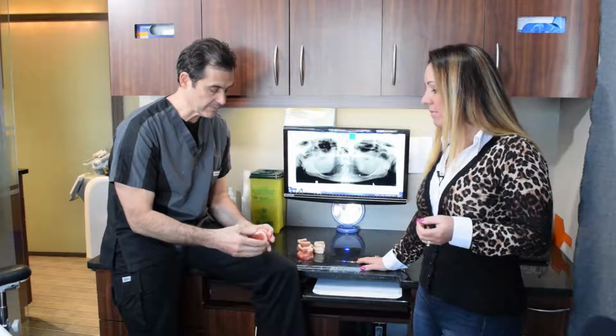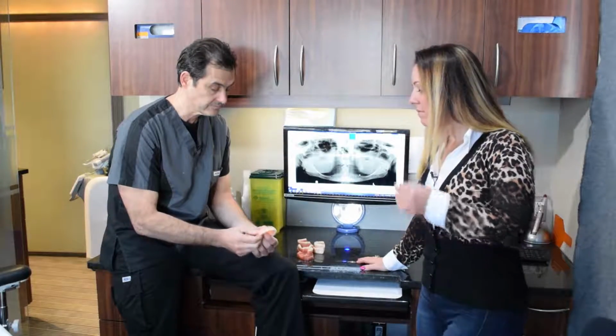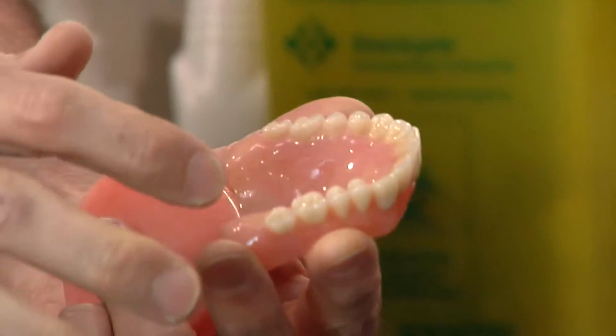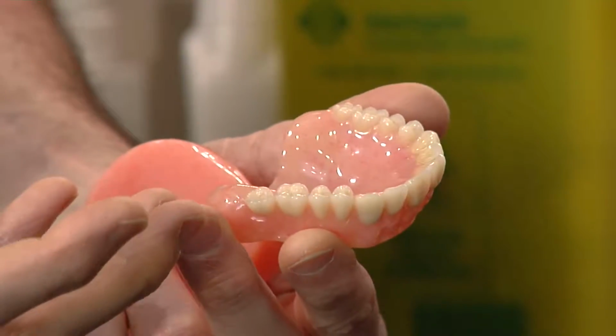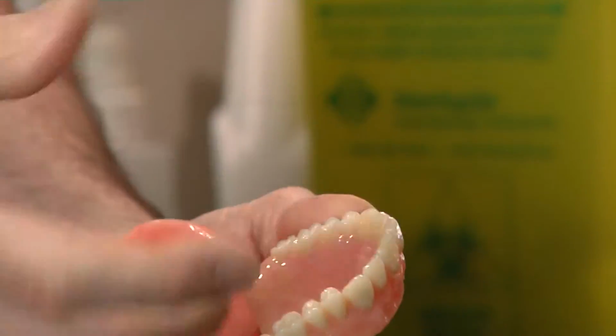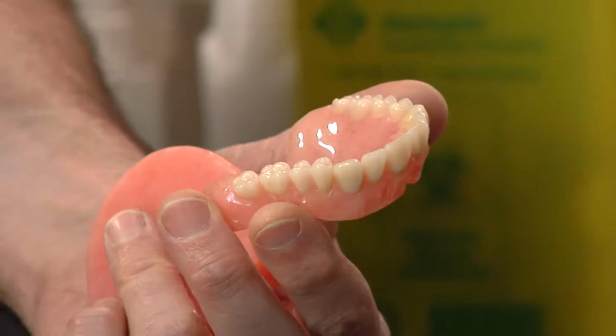But oftentimes people are coming in, they're already wearing some kind of prosthesis. Typically what people are wearing is a denture, like this one. So just so everybody understands what a denture actually is, because people have all these different misconceptions. The teeth on a denture are made in a factory. They're pre-made. There's different molds that the companies have, so they could come in different colors, shapes and sizes, but they're all basically a bunch of plastic teeth that are pre-made in a factory.